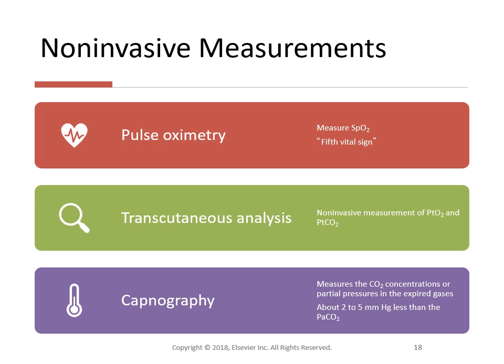When compared with analysis of arterial blood hemoglobin saturation by invasive sampling and co-oximetry among patients with good perfusion, most pulse oximetries are very accurate. They're within 2% of oxygen saturations equal to or greater than 90%. As oxygen saturation falls, SpO2 accuracy also falls and becomes less reliable, necessitating the use of a co-oximeter to accurately determine oxygen saturation of hemoglobin.